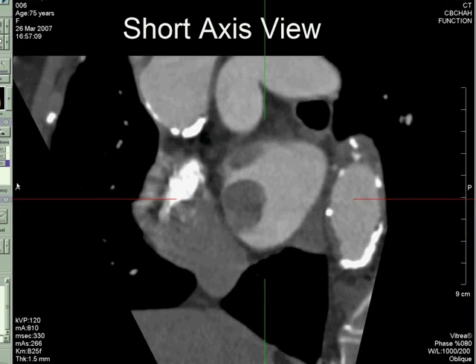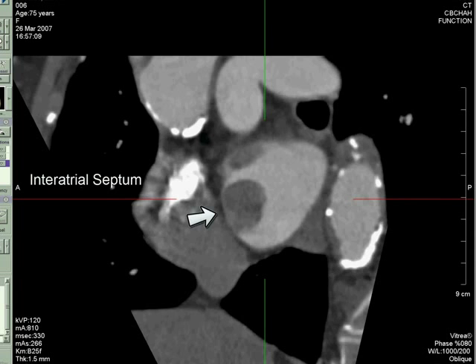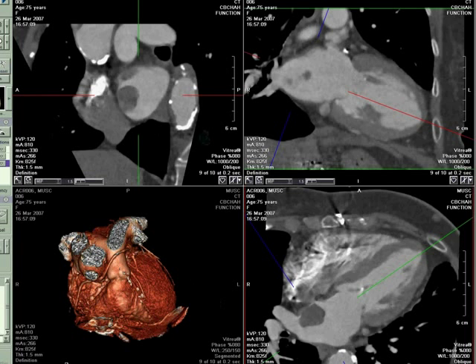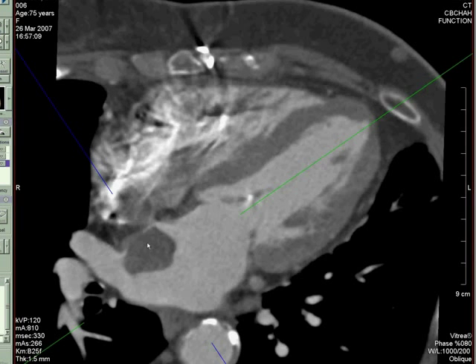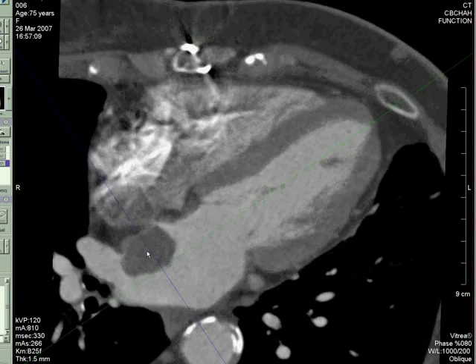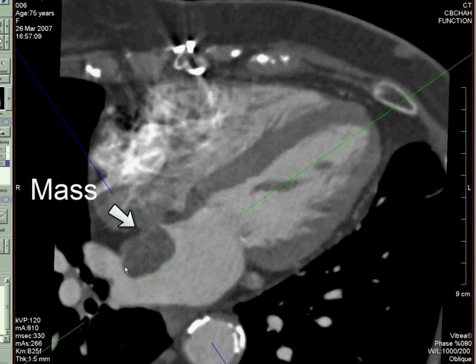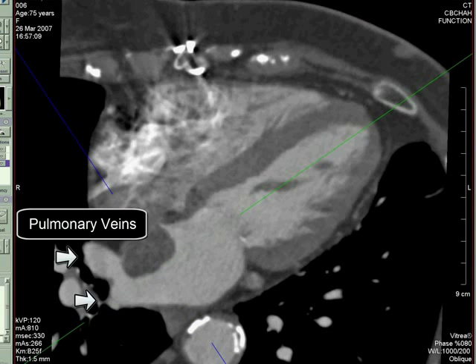The short-axis view shows that the mass has a broad-based relationship or attachment to the interatrial septum. This is confirmed by reviewing the four-chamber view, and the mass does encroach on the inflow for the right superior and inferior pulmonary veins.